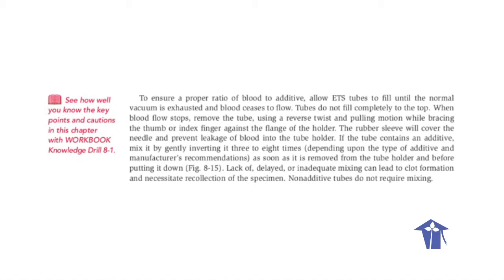If the tube contains an additive, mix it by gently inverting it 3 to 8 times, depending upon the type of additive and manufacturer's recommendations, as soon as it is removed from the tube holder and before putting it down. Delayed or inadequate mixing can lead to clot formation and necessitate recollection of the specimen. Non-additive tubes do not require mixing.